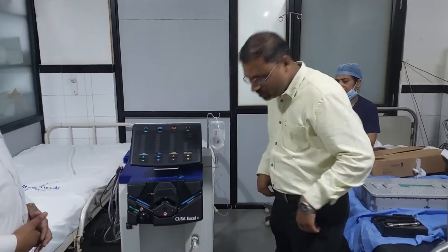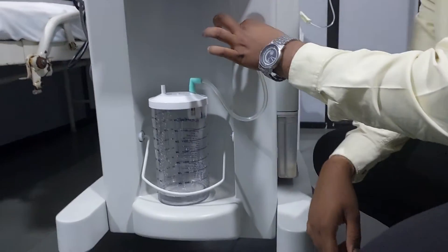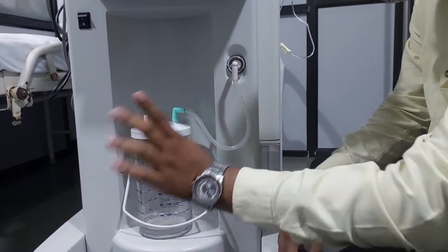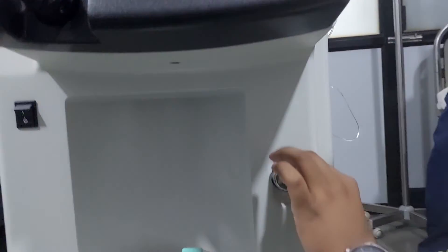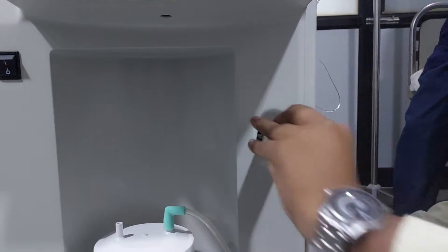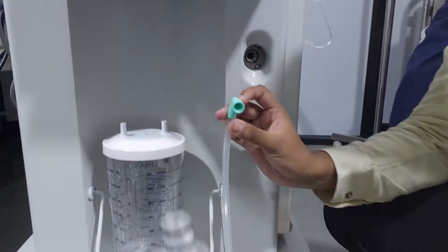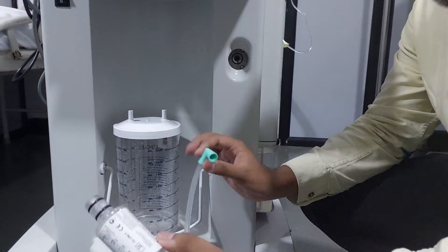They have provided one contamination filter and this is your suction jar — 2000 ml. First thing you have to remember: how to fix it and how to remove it — just pull it out. It comes out. This filter is provided with the machine to avoid contamination inside the machine.